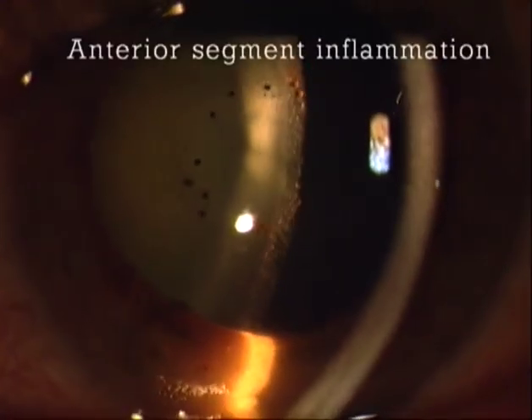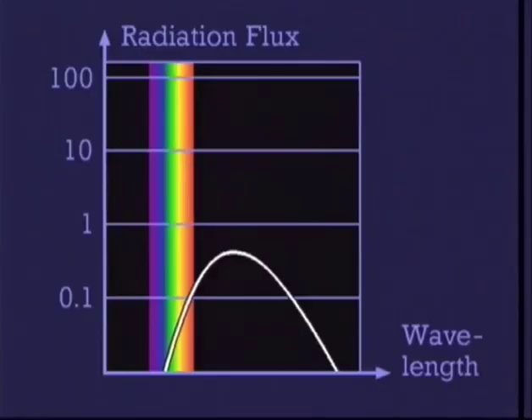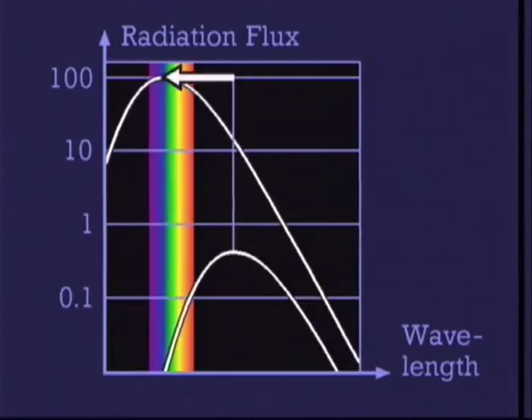An excellent dark background is, for example, the black pupil. For recognizing even faint scattering, the light beam should be made sharp and short so that both margins can be observed against the dark background. Comparing the area of scatter and the non-scatter vicinity improves the identification of very faint scatter. And finally, scattered light can be increased by maximizing the brightness of the light through hypervolting the light bulb. Hypervolting also proportionally increases the contents of short wavelength rays, which are especially effective for generating scattered light.